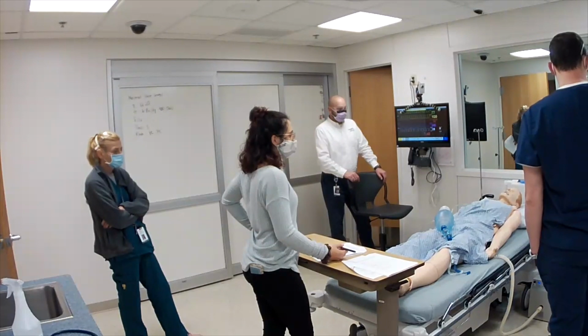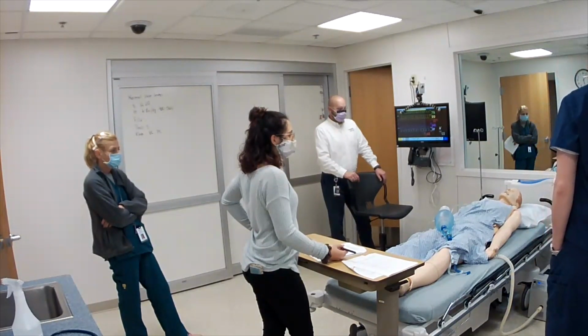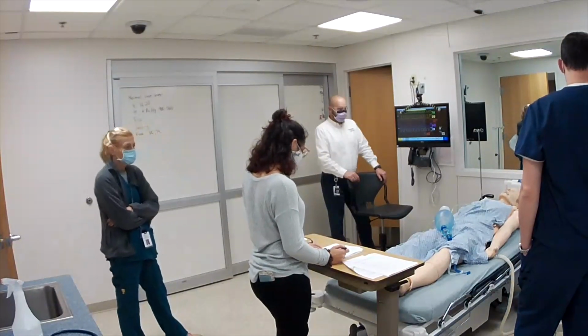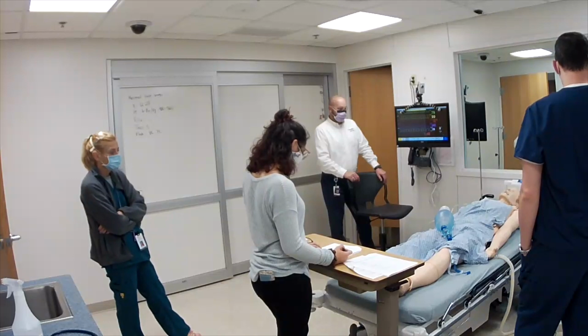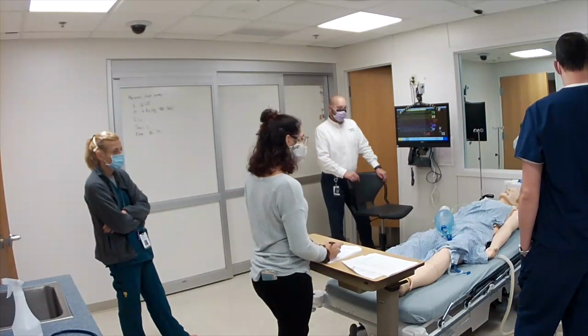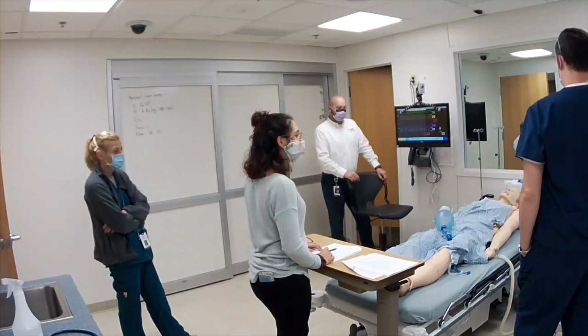Blue waveform is just tidal volume. Yep, it's volume. Yep. So you have pressure, flow, and volume. Perfect. So what about our numbers on the vent? So on this vent, across the bottom are what we've set. So those knobs underneath correspond to what we're doing, right? So let's start with the numbers on the right hand side there.